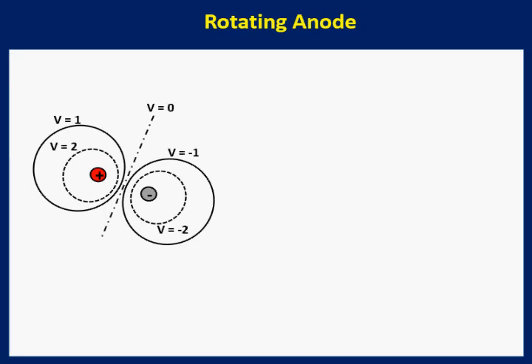The potential decreases with distance from the dipole. In this example, the active and reference electrodes lie on different isopotential lines. They record a different voltage and generate a differential signal. In this example, the voltage difference is 1 millivolt. This will be amplified by the differential amplifier and seen as stimulation artifact.